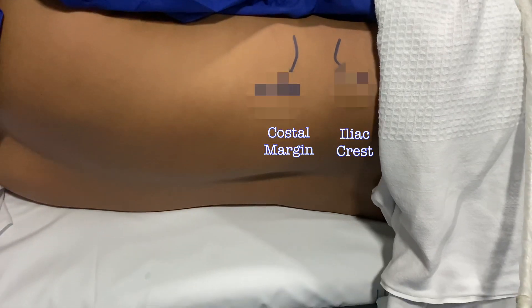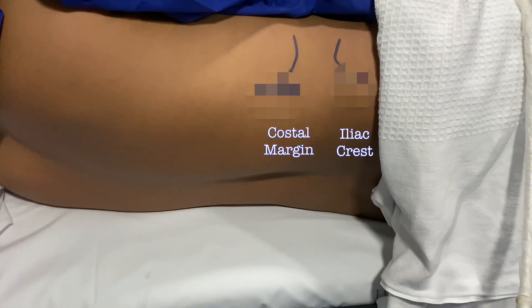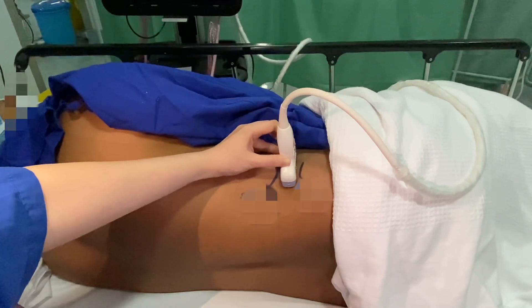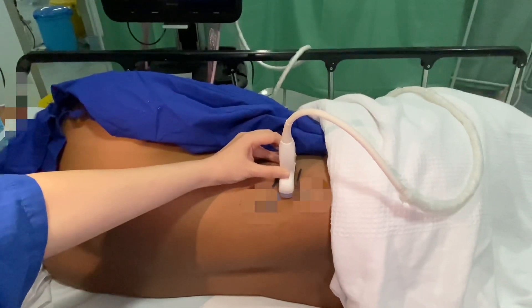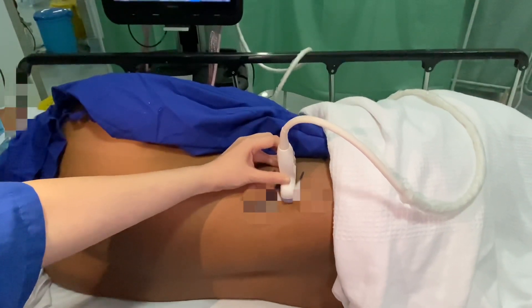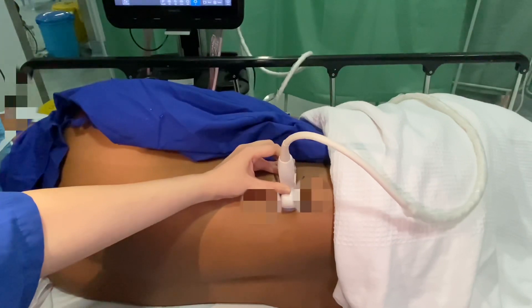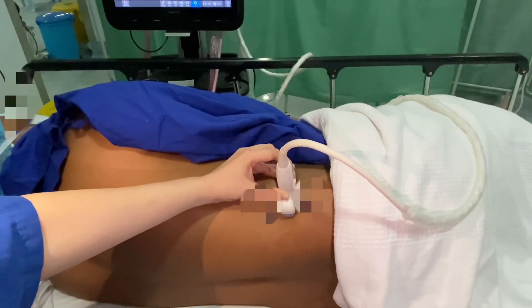First, palpate for the costal margin and iliac crest. The transducer is placed in a transverse orientation at the mid-axillary to posterior-axillary line, in between the costal margin and iliac crest.